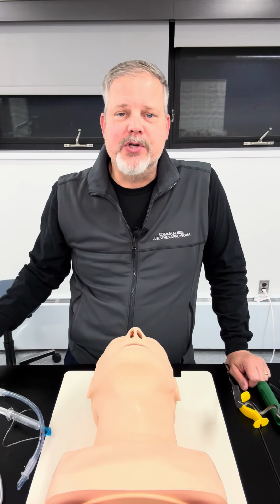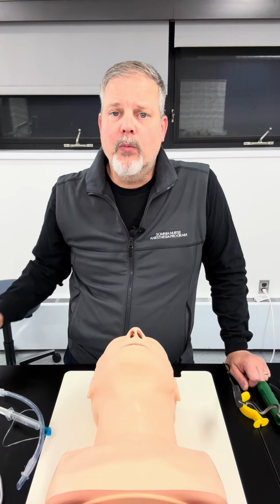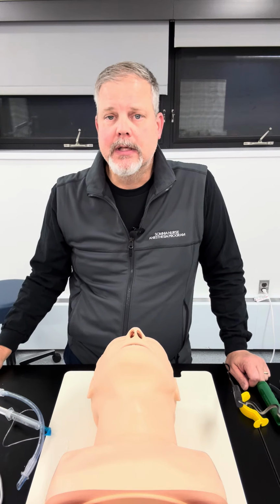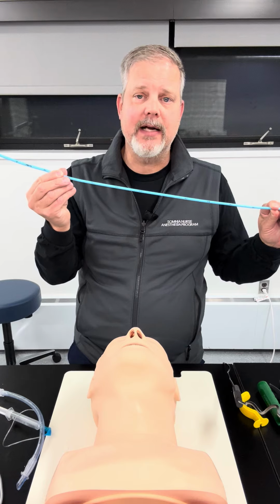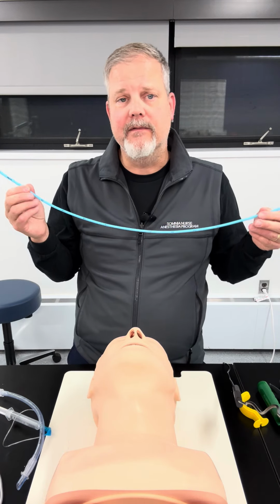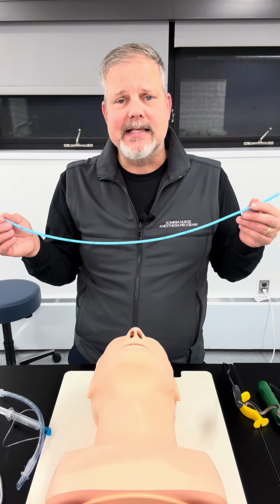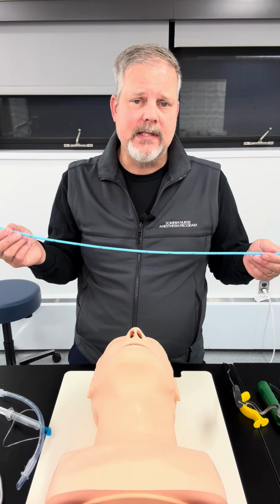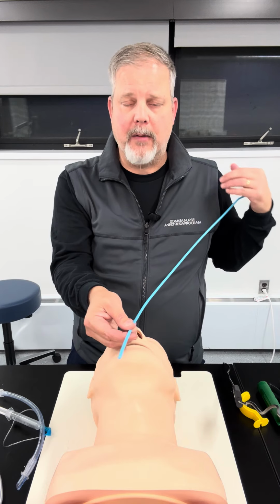Hey, coming to talk to you again about another airway technique that we can utilize when placing endotracheal tubes. So what we're going to talk about today is using a bougie. And if you're not familiar with a bougie, it is this flexible device right here. The purpose of it is, if we're having a view that's not really great of the vocal cords, we can utilize this to place it through the vocal cords and then guide our endotracheal tube over it so that we can get proper placement.